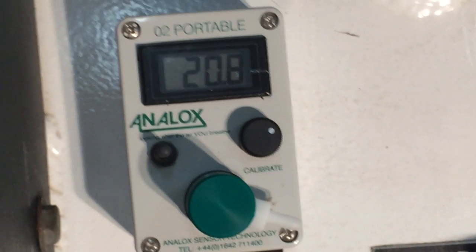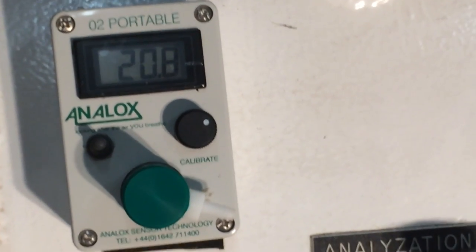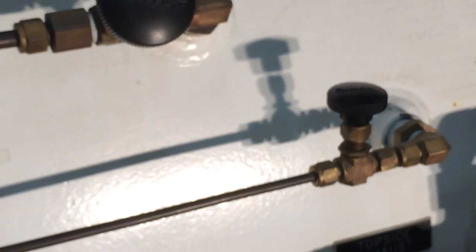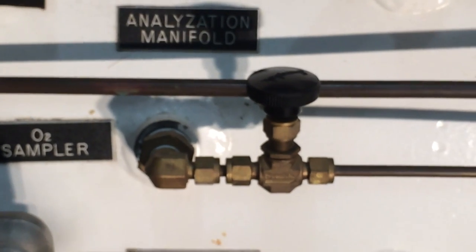We have an oxygen analyzer kept on the outside to sample the atmosphere of the air inside the chamber. This is done via a flow meter connected to a manifold that allows air to flow from either the interlock or the outer lock valve — only one at a time. Most commonly it will be the interlock, because that's where our divers are breathing oxygen.